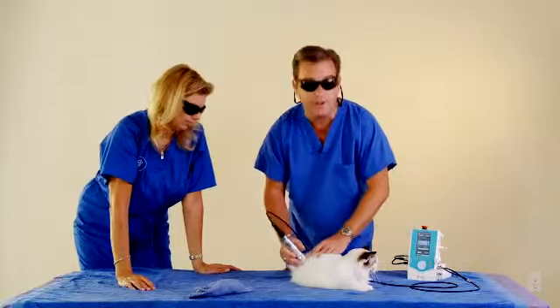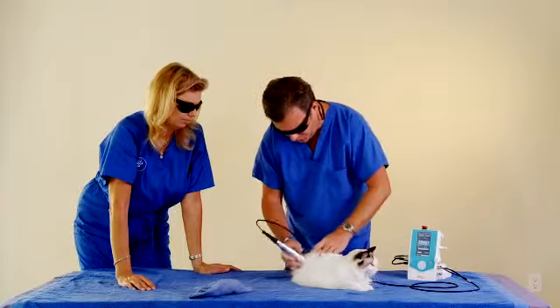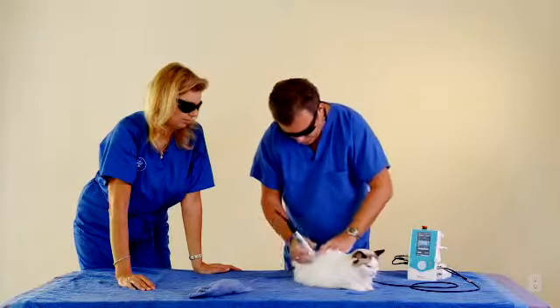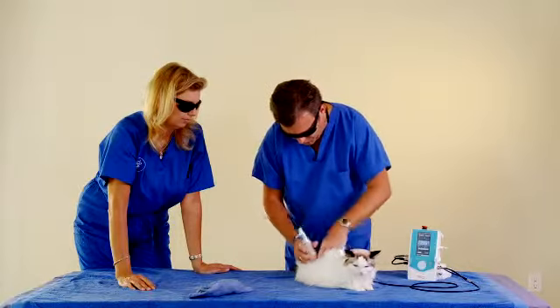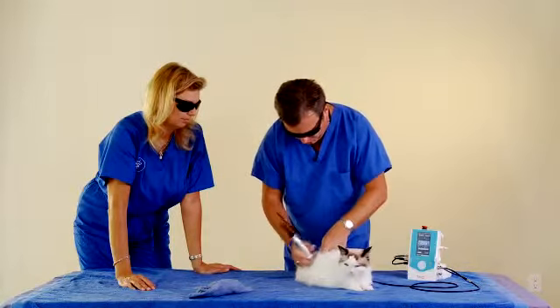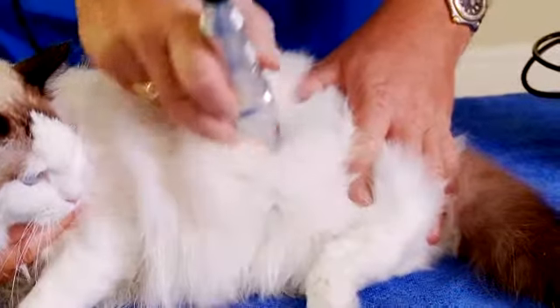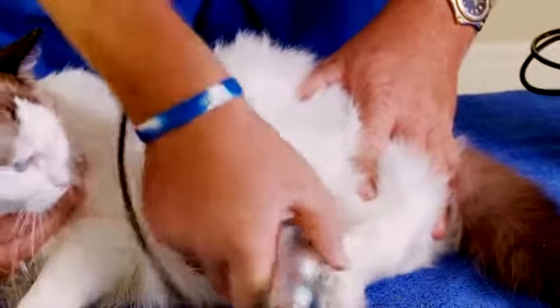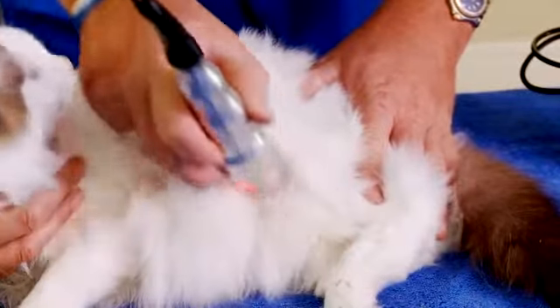Always treat a little bit under instead of using too much right off until you get really comfortable. And for this arthritic stifle, she's kind of got this leg pulled in, and I'm just going to go around it. I can feel my joint. I know where I need to go. She's a younger cat, so again, consider the nutrition, hydration, condition of the cat that you're treating.